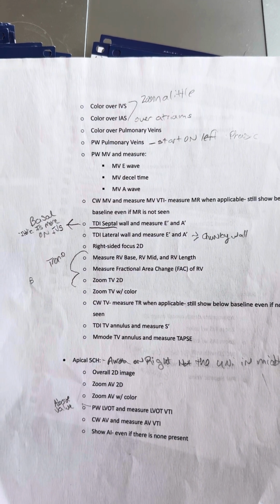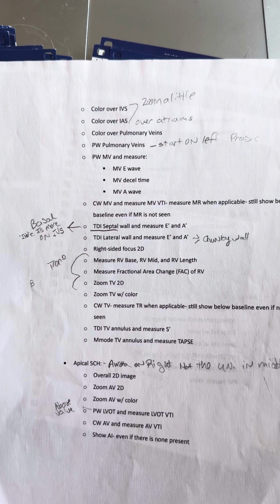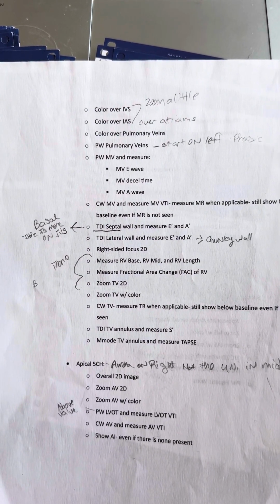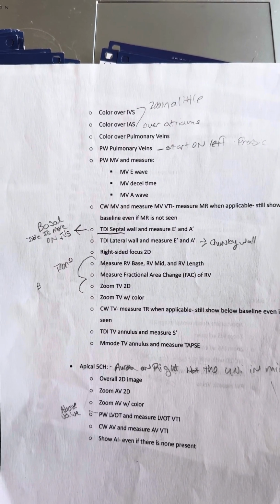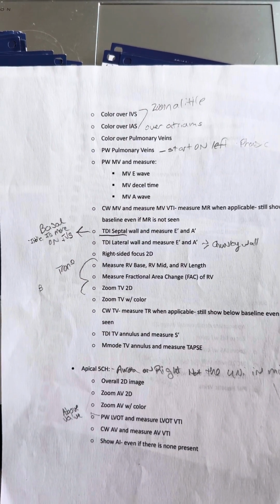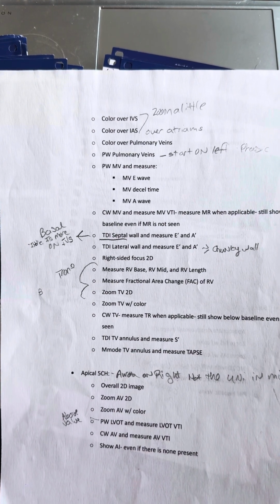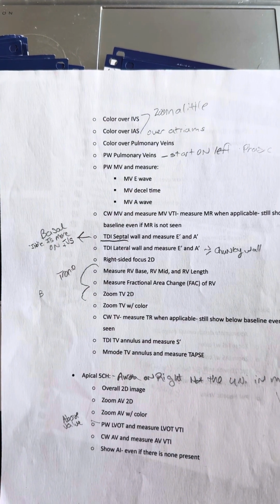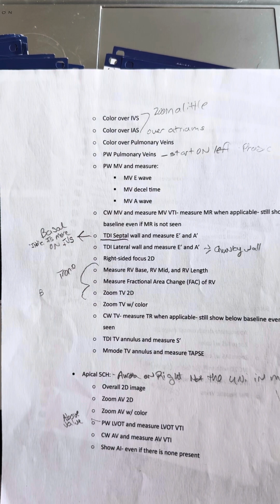TDI your septal wall. It's basal. Indicator is more on IVS. You update and you measure your E and A waves. You do the same TDI for lateral wall and measure E wave and A.